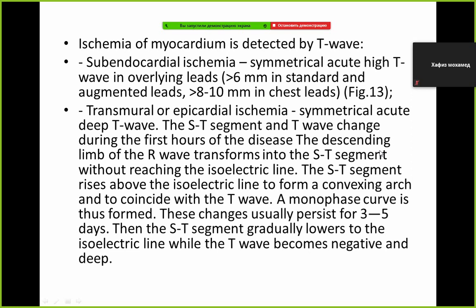The descending limb of the R wave transforms into the ST segment without reaching the isoelectric line. The ST segment rises above the isoelectric line to form a convexing arch and to coincide with the T wave. So a monophase curve is thus formed. These changes usually persist for 3-5 days of STEMI.